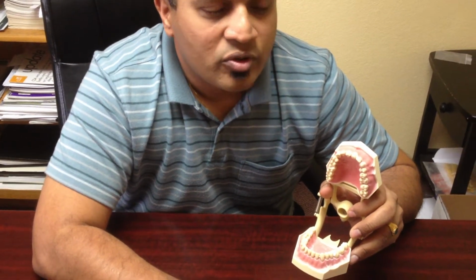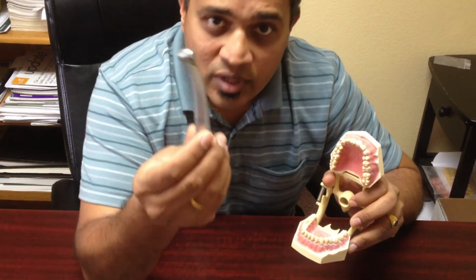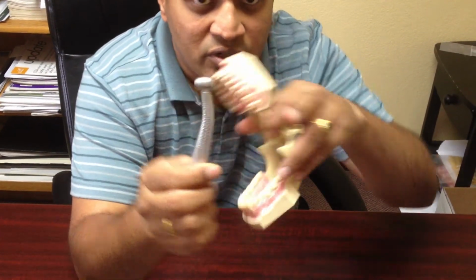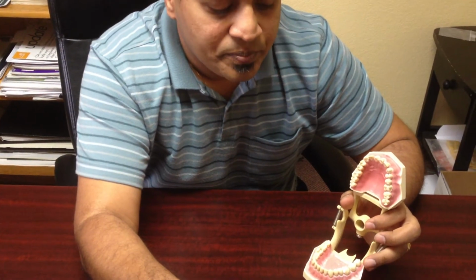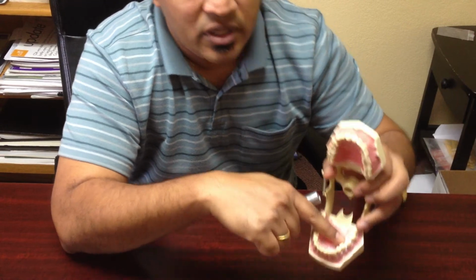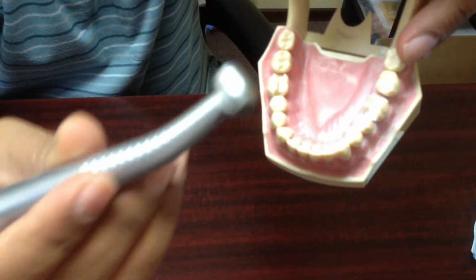So the idea that I'm trying to portray is, we have a drill that we generally use to drill people's teeth with, and there's a thing that sticks out of here that cuts your teeth. It's called a burr. Normally we use our hand, and like this tooth has a big cavity that's been drilled out. So we just use a drill and kind of drill it out of that.